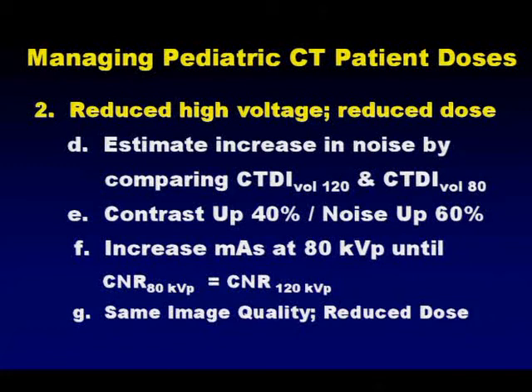Now, in the dedicated pediatric hospitals, they're moving towards exam-specific protocols. It's a lot of work, especially if you have different scanners in your department. Again, if you're the consultant going in to the adult hospital that does pediatrics occasionally, more than likely that adult hospital is not going to be doing the more complex pediatric exams. They're going to be doing abdomens and pelvises and maybe some chests. And grab the low-hanging fruit. Find the techniques that they're using on kids the most and start to do these kinds of protocols.